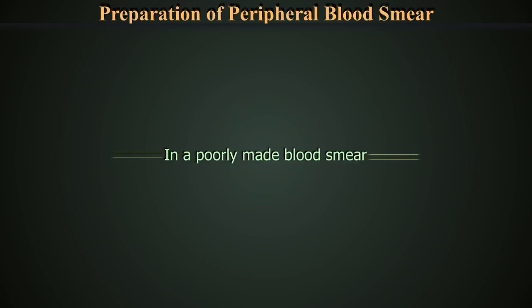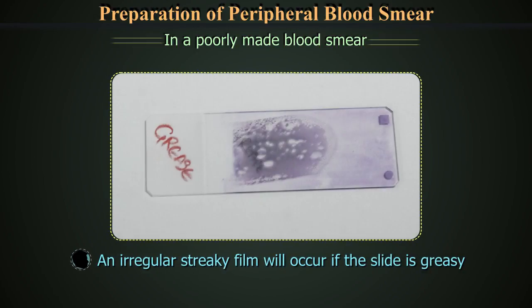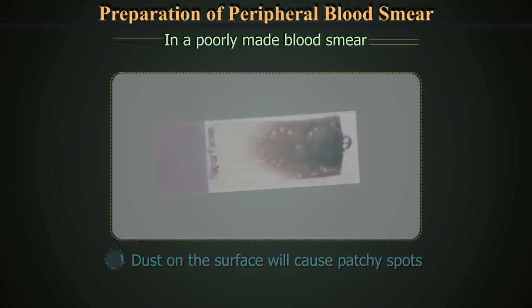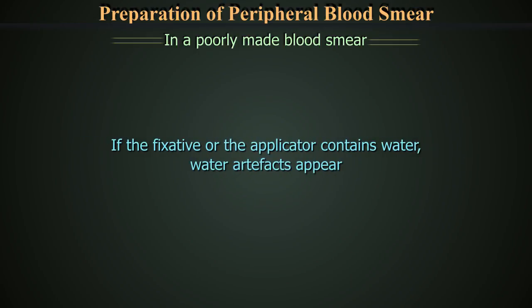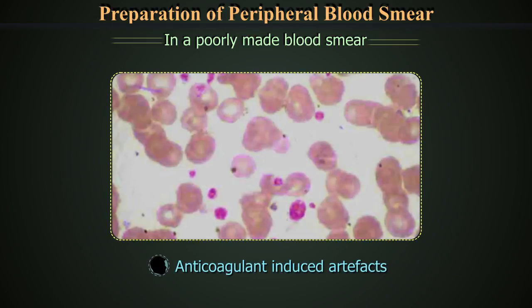In a poorly made blood smear, leucocytes may be unevenly distributed, with monocytes and other larger leucocytes being pushed to the end and sides of the spread. An irregular streaky film will occur if the slide is greasy. Dust on the surface will cause patchy spots. A film made with inconsistent pressure and an irregularly edged spreader gives an uneven appearance. If the fixative or applicator contains water, water artifacts appear in the blood film. These are also storage-related and anticoagulant-induced artifacts visible on the peripheral blood smear.